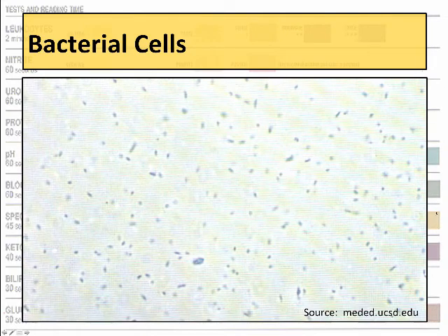Also, something that you might see would be bacterial cells. They are very, very small, much smaller than a red blood cell, much smaller than a yeast cell. And so what's important is that if you see lots of little specks under your microscope, you may in fact have to go up to your high power objective to see these things.